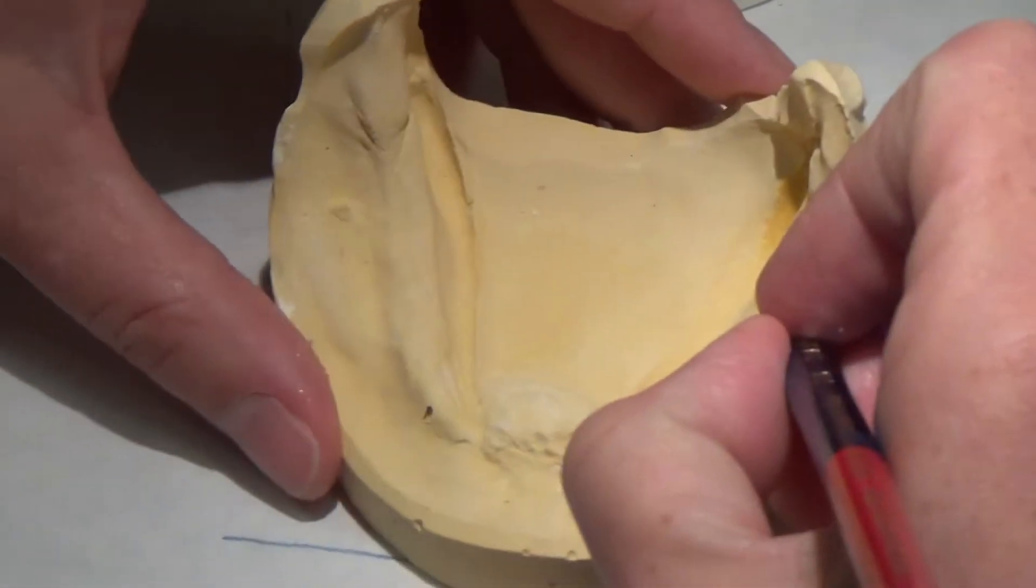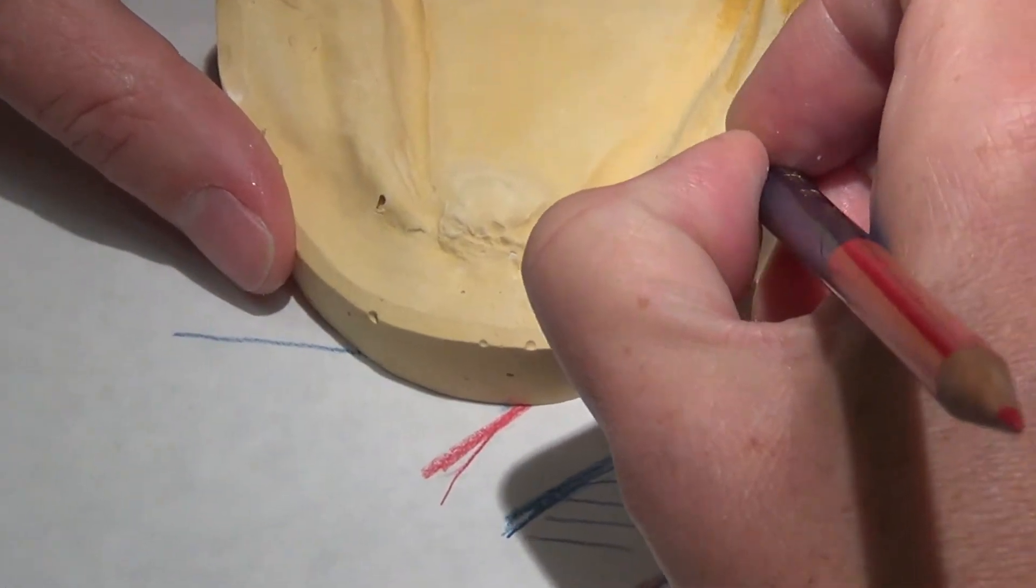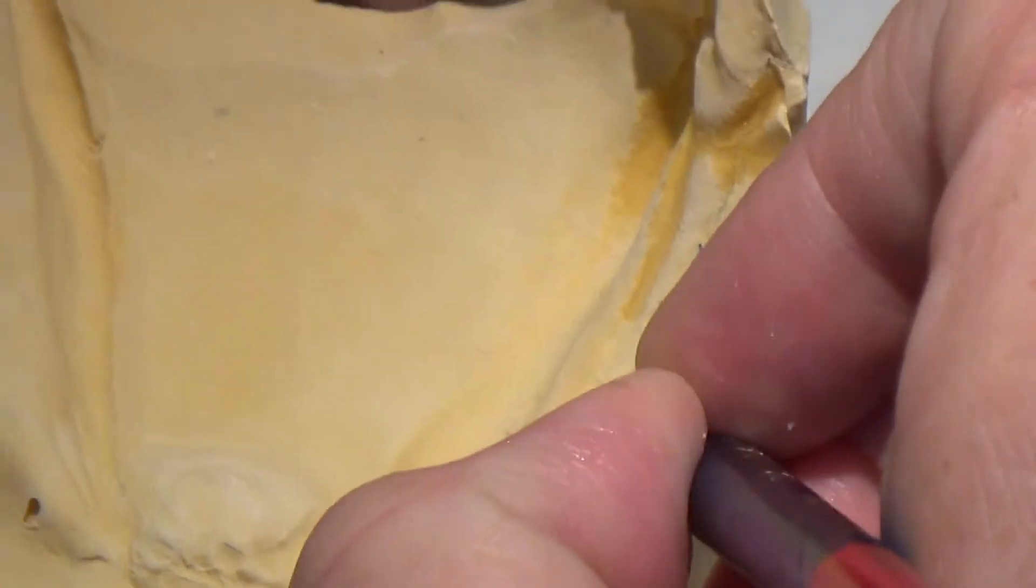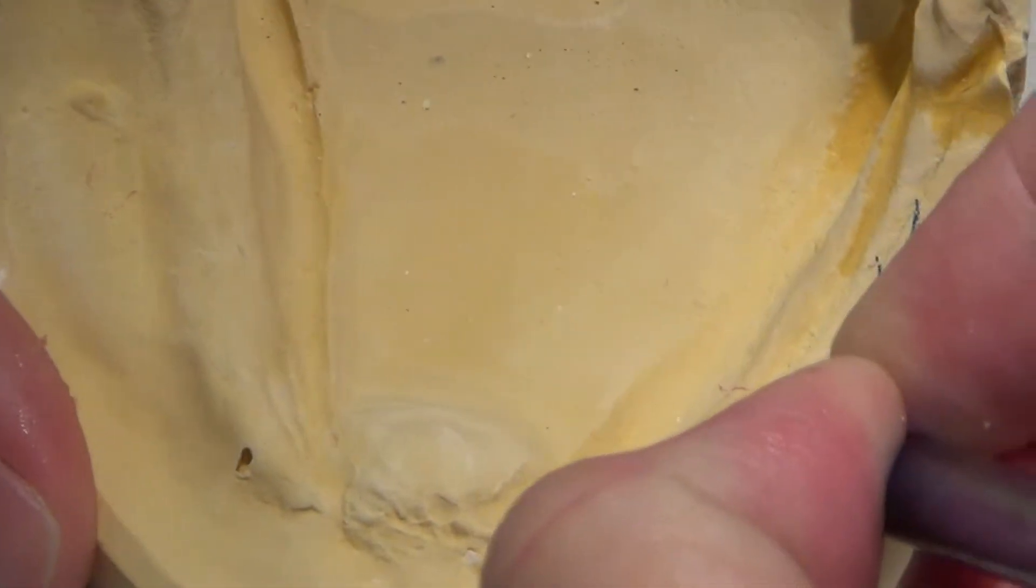So on the mandible, I'm going to identify the buckle shelf. Hers are rather large, and I'm going to try to take advantage of quite a bit of this space here.